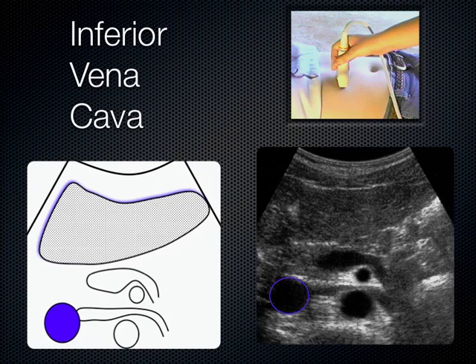Okay. One more time with the anatomy then. What's this? Good. What's this? What's this? What's crawling over the SMA? Splenic vein, very good. What's this tissue out here? Pancreas. Liver. And what's getting nut cracked here? Left renal vein dumping into the IVC.